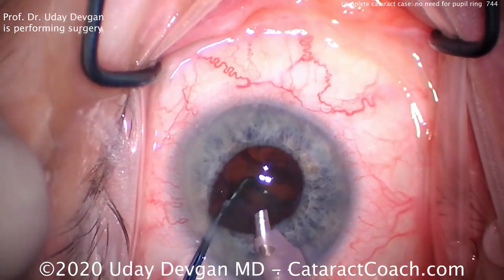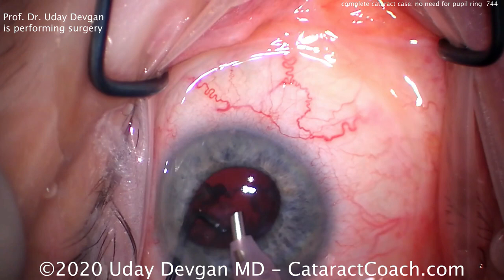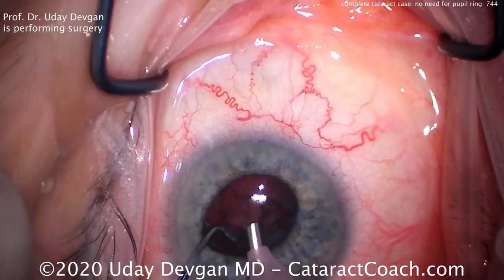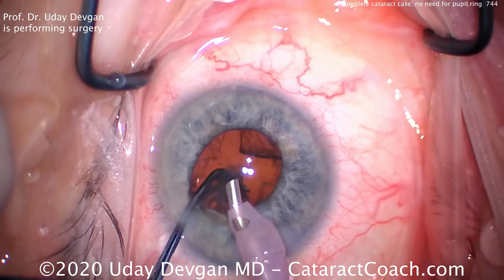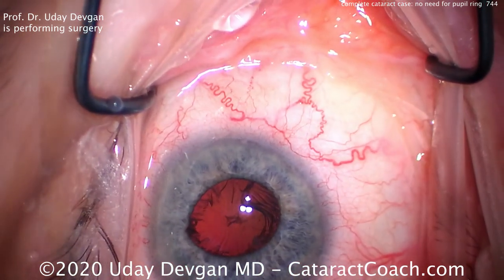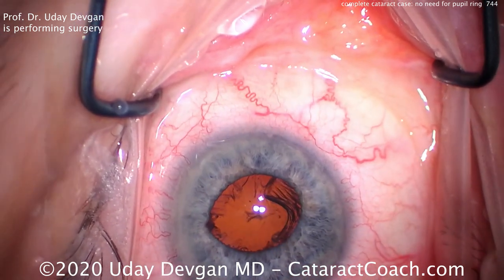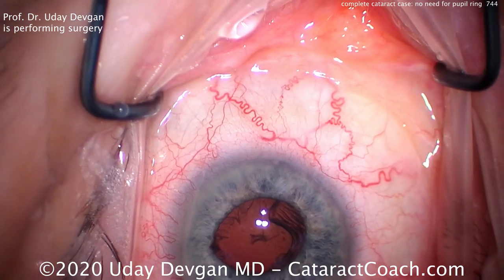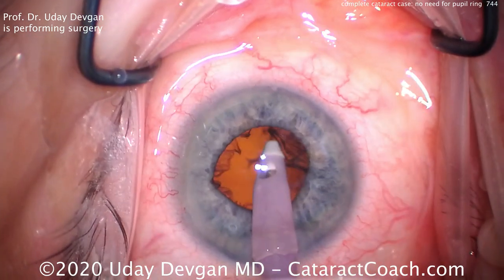Now taking out the epinuclear shell, very careful to bring it centrally. I don't want to place the phaco tip under the iris where I can't see it. Remember, if this phaco tip comes in contact with the capsule, it'll probably damage it. So here comes the rest of that epinuclear shell. Notice the chopper in the safe position just to prevent the capsule from coming forwards. Now we're definitely down to about a 4mm pupil or a pinch less. I want to switch to the IA probe, and now we want to keep track of the cortex in our mind to make sure we're not going to leave any behind. We'll also check at the end.